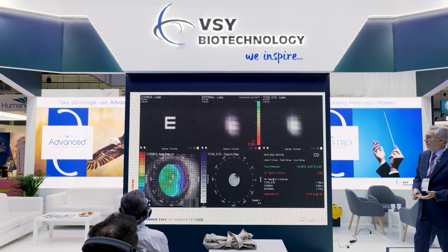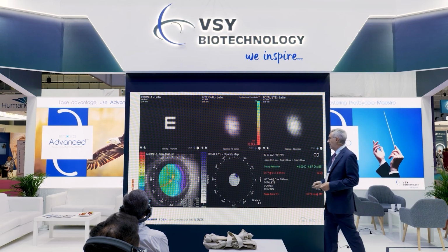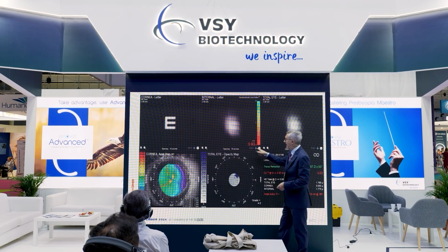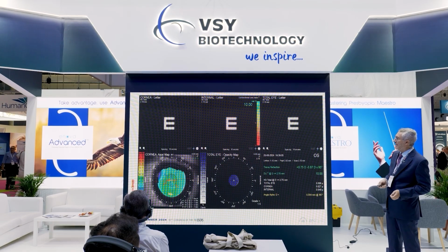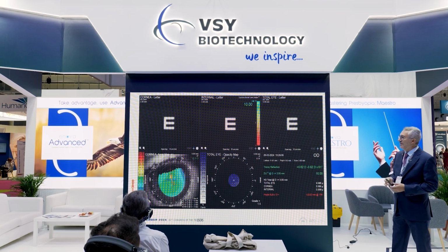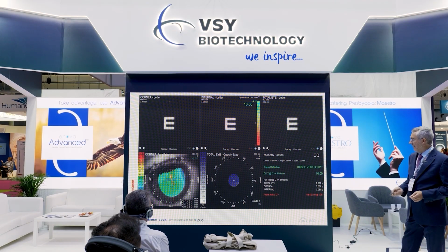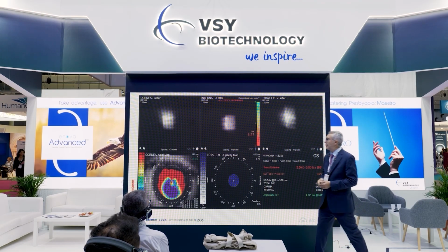This is a typical good case of a professional driver who was offered this implant with a nuclear cataract and a narrow anterior chamber. This is the dysfunctional lens index that we analyzed before, and it was converted into 10 in the postoperative period. We have similar results, and because of the larger area, even with suboptimal angles, either kappa or alpha, we find very good patient satisfaction and very good results.